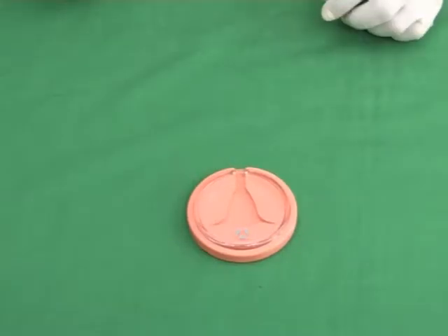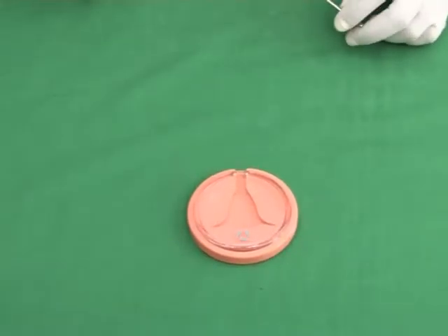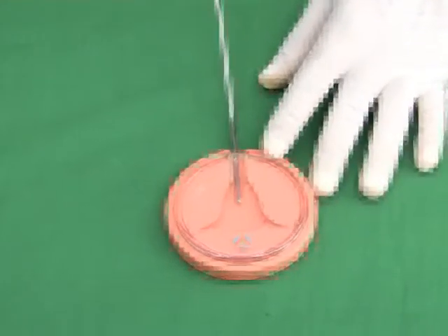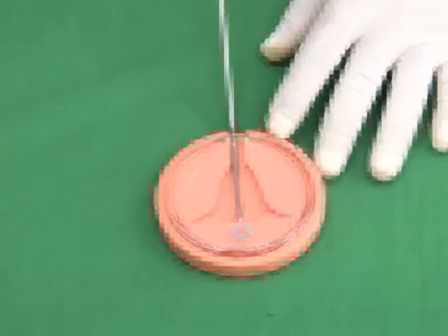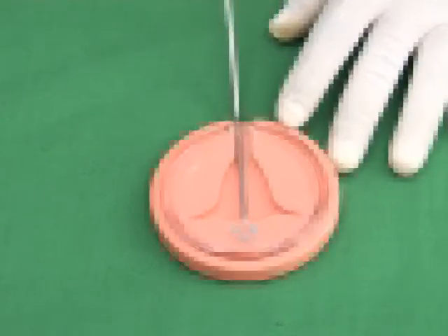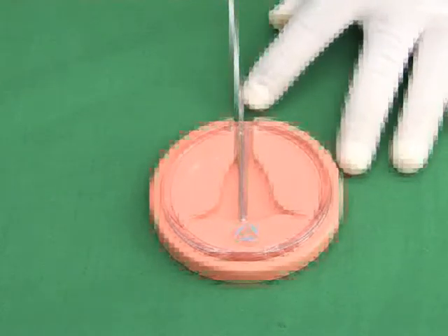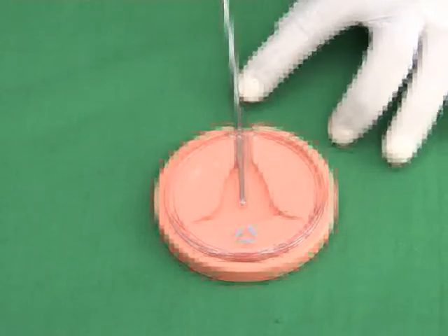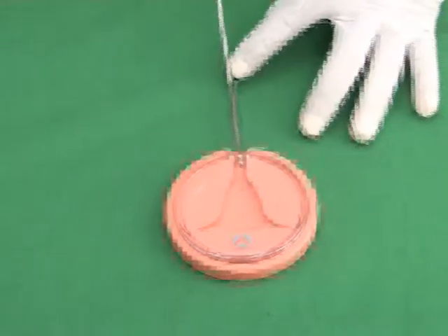Before the insertion of the intrauterine device, you have to measure the direction and the length of the uterine cavity by using the uterine sound. Once the length of the uterine cavity is measured, you have to keep a mark on it.